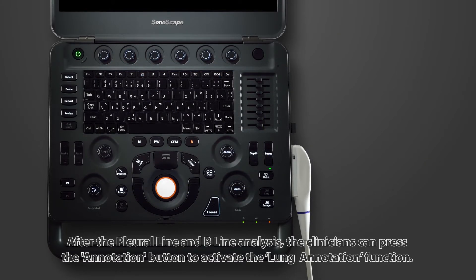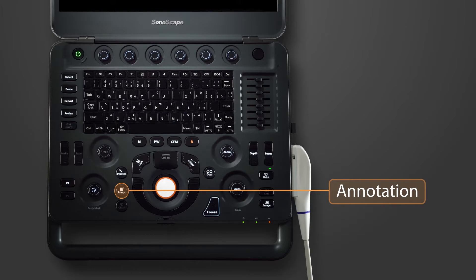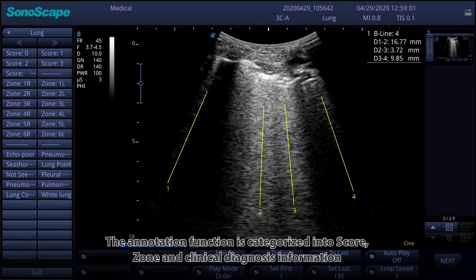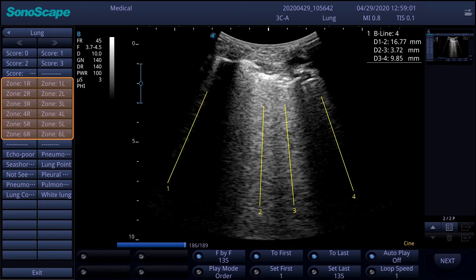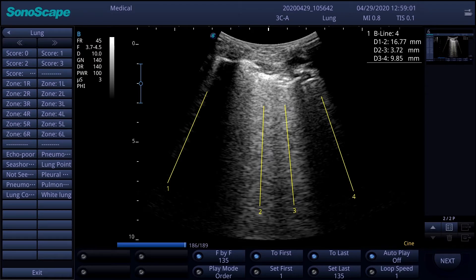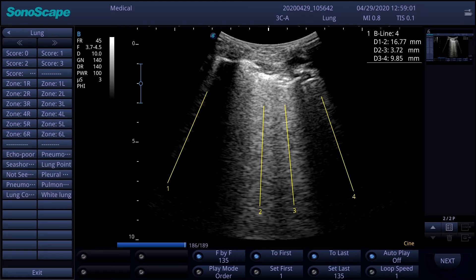After the pleural line and the beeline analysis, clinicians can press the annotation button to activate the lung annotation function. The annotation function is categorized into score, zone, and clinical diagnosis information. Like the ultrasound score, we can see 0 to 3 under the score category, L and R as well as 1 to 6 under the zone category. Under the clinical diagnosis information, we can see annotations such as not seen abnormal, pneumothorax, pleural effusion, etc.